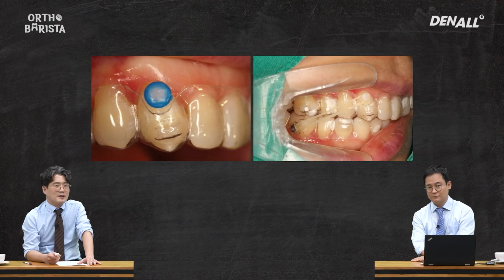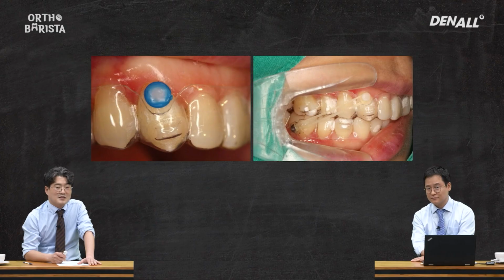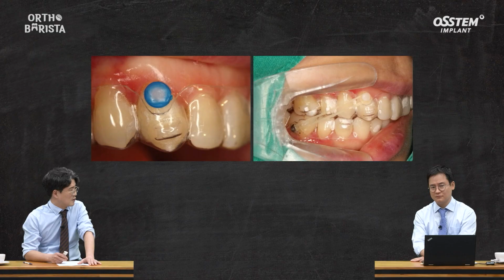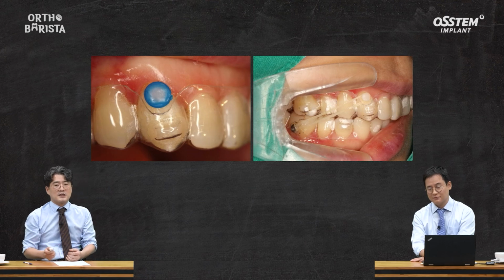So, there actually is a tip to attach a button. Dr. Lee shared this tip. Thank you for that. No problem. I make a lingual button by using an O-ring or a separation ring. It seems like it might fall off, but it doesn't fall off easily. No, it hardly falls off. When you attach the ready-made clear button, it actually falls off too easily. It really does. So, anyway, I started using class 2 elastics almost from the beginning.